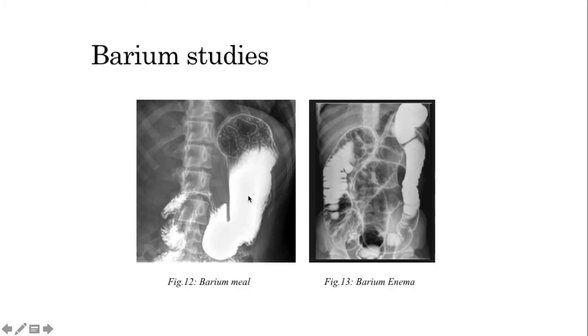And here you can see the stomach. It's nicely highlighted. You can see the fundus here. It's full of gas. And some of the rugae here are highlighted with contrast, since the patient has probably been moving. The image is quite probably in the oblique position, from the position of the spine, a little bit oblique. You can see the spinous process here, indicating an oblique view of the stomach during a barium meal. You can see this is the stomach here.